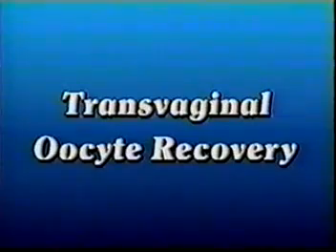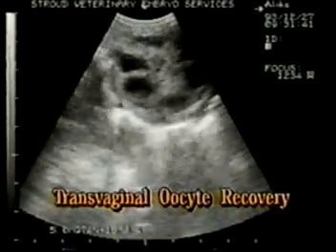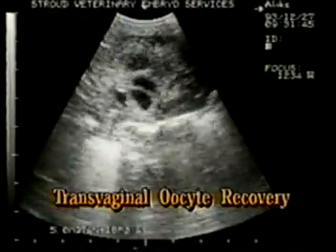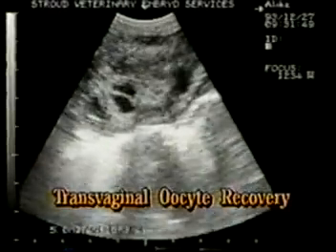To be as complete as possible with this video, transvaginal oocyte recovery has been included. A convex linear transducer is utilized for this procedure, giving a flashlight-like appearance to the ultrasound background image on the monitor. A superovulated cow in standing estrus is used for the model.